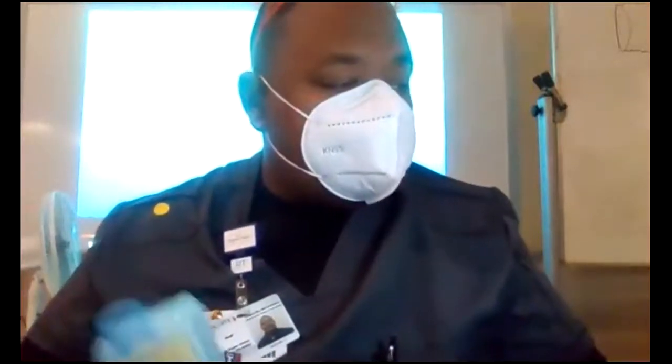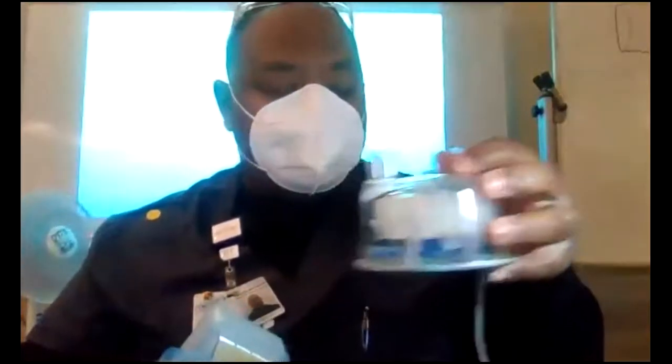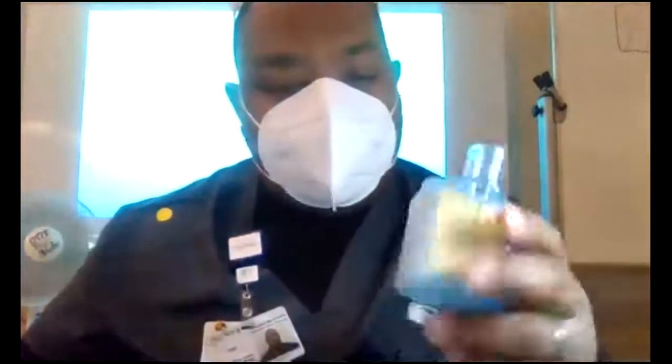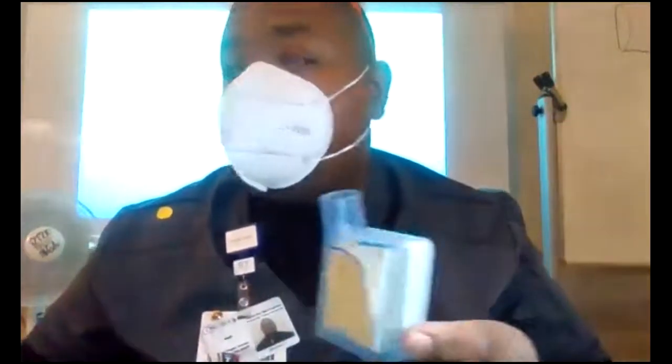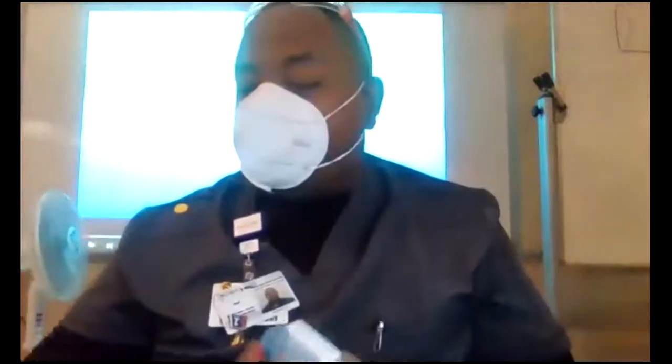So if you can't use it, then what would you go to? You just get another one, or you go to your cascade. Go to your cascade if you couldn't use this anymore. This is mainly a temporary humidifier. All right, let's take a break and come back.